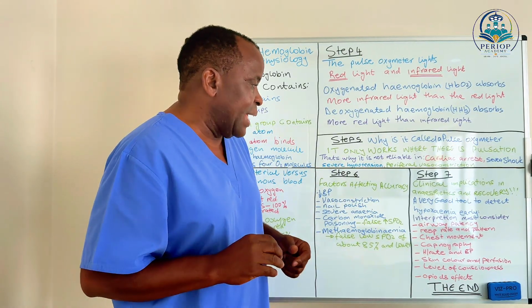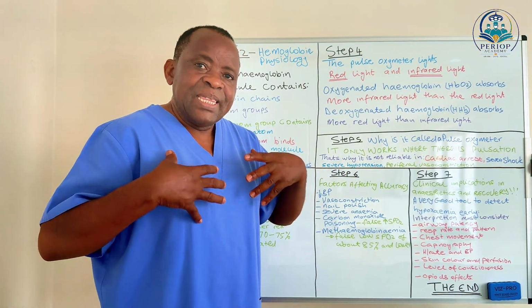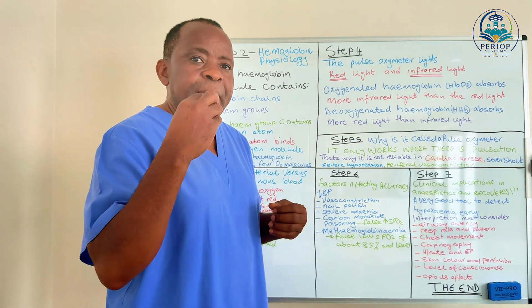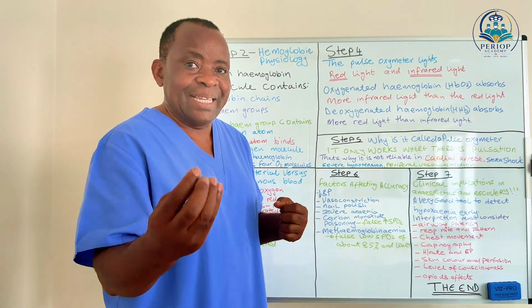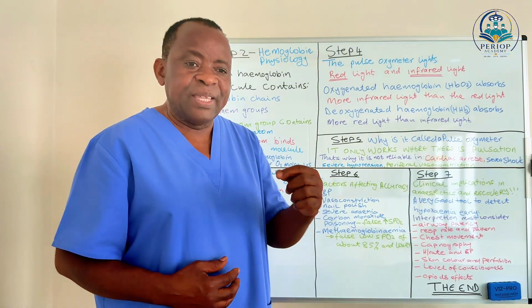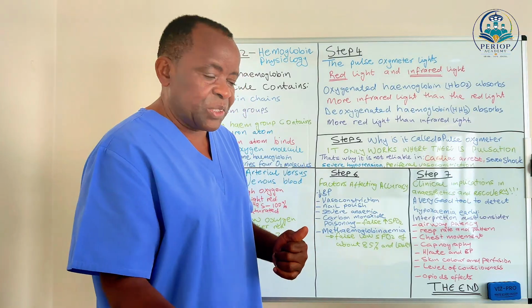And as we are looking after the patient, either way in theatre and recovery, we also want to assess the respiratory rate and pattern. The greater the tidal volume the patient creates, the better the oxygenation results are, and the better the values of that oxygenation are translated on our pulse oximeter.